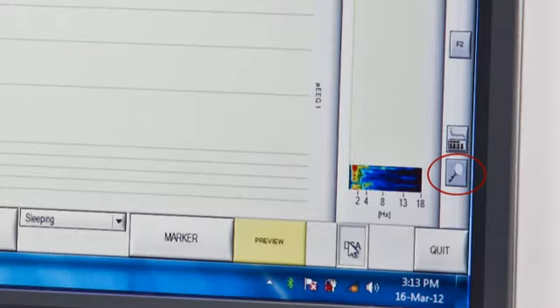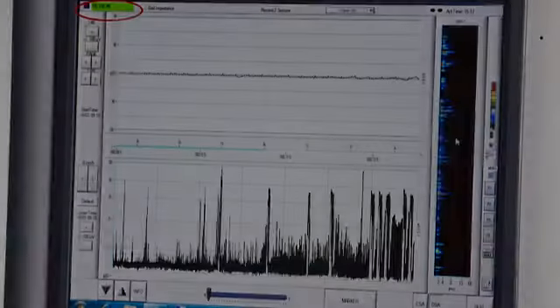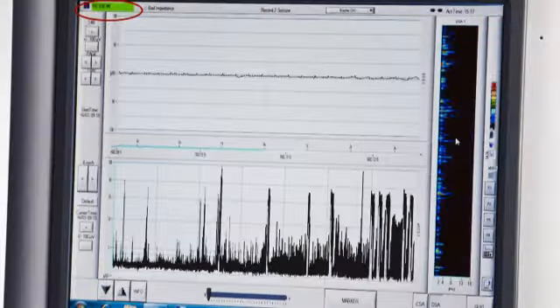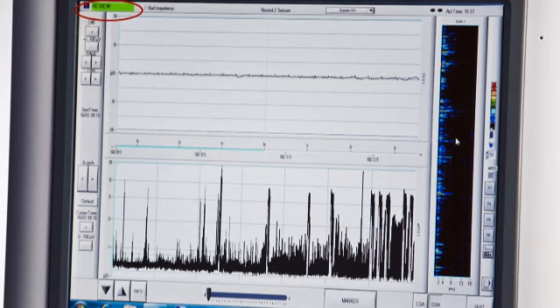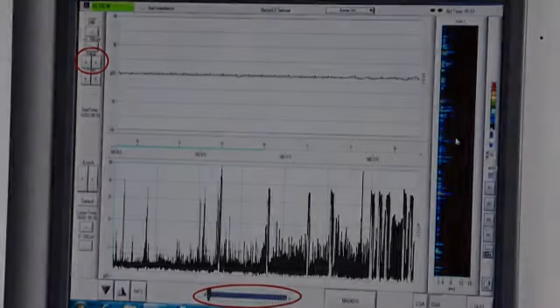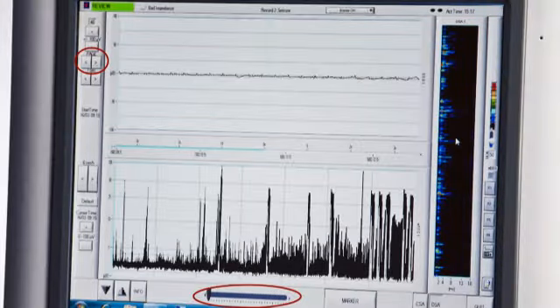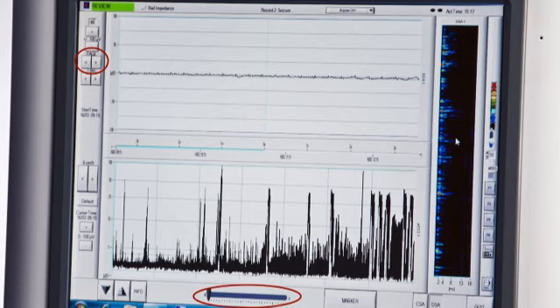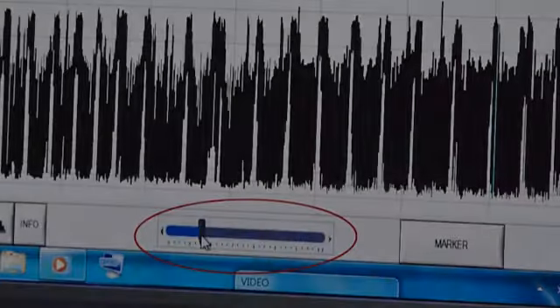The user can view the trace while still recording the patient data. Click on the magnifying glass to go into the review mode. You can scroll through the EEG, AEEG and spectral array using the page buttons on the left panel or by using the scroll bar at the bottom.